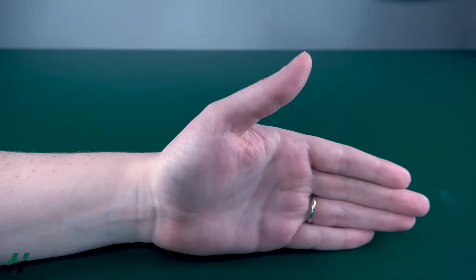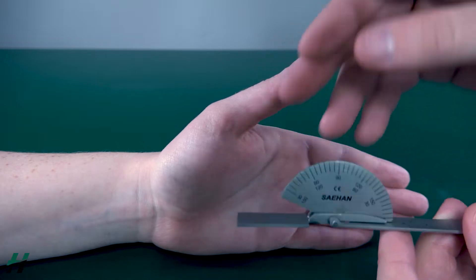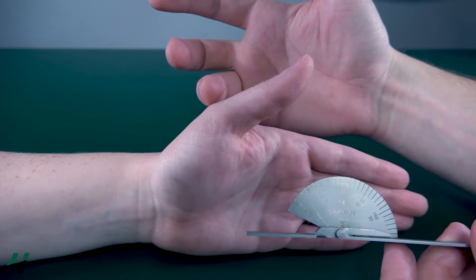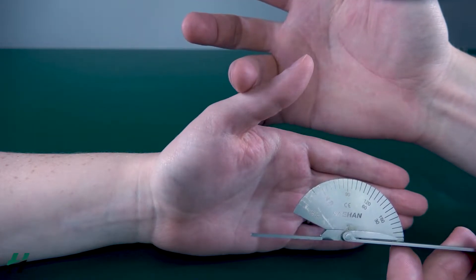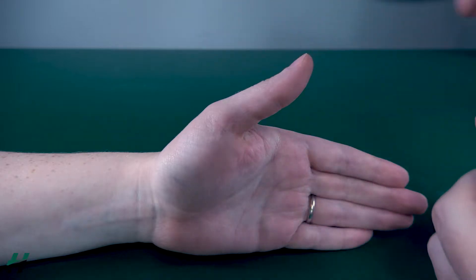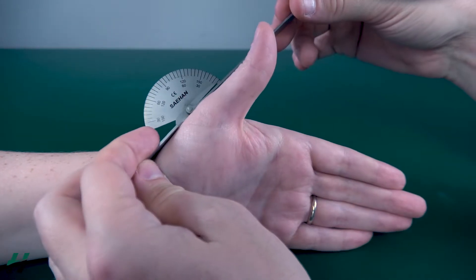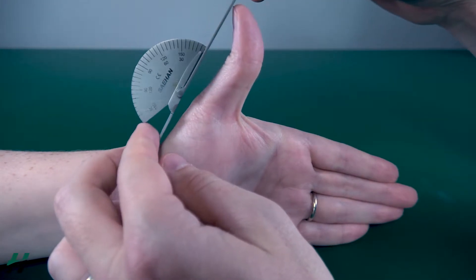Measuring thumb MP extension. Just like flexion, you want your stationary arm to be on the first metacarpal, your axis on the MP joint, and your movement arm on the proximal phalanx. Rachel, bring your thumb into extension for me.